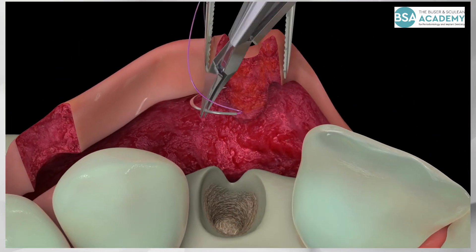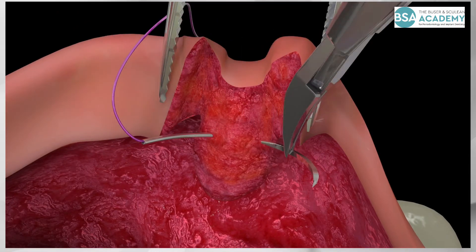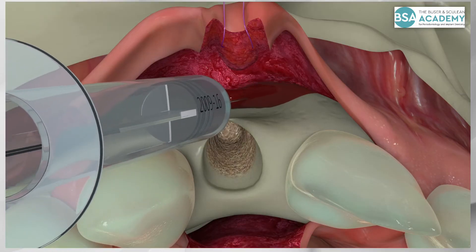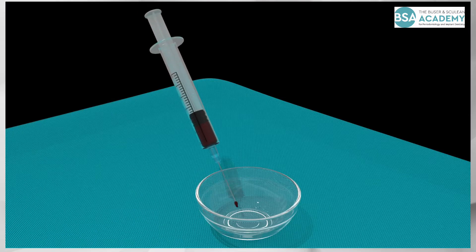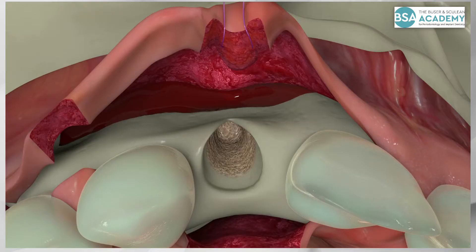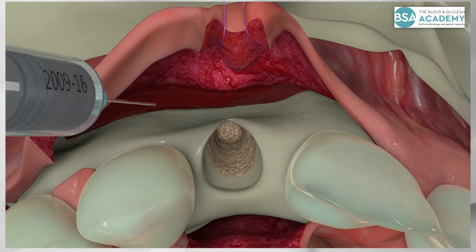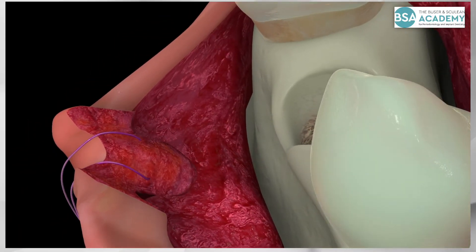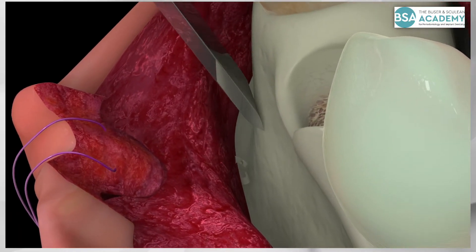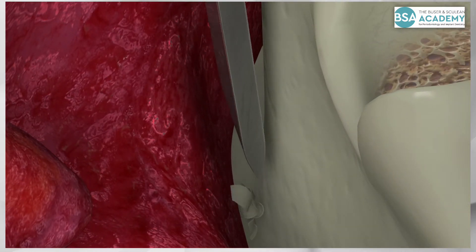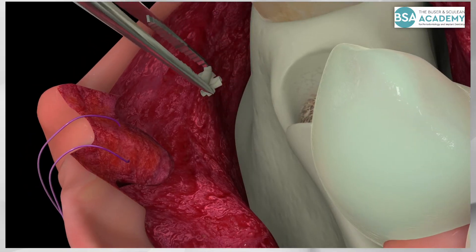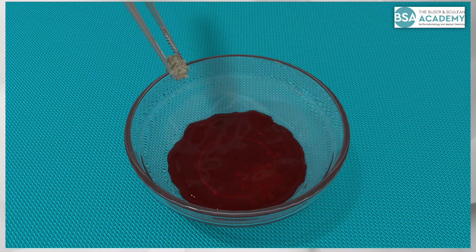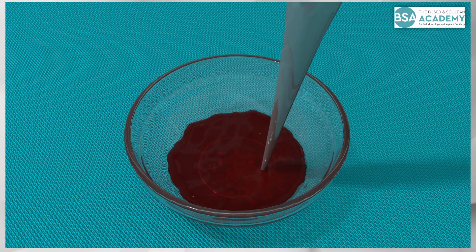A retraction suture is applied to keep the flap off the surgical site during implant surgery. Blood is harvested with a syringe and stored in a sterile dish. Autogenous bone chips are locally harvested within the same flap from the cortical bone surface — either with a flat chisel at the nasal spine, or with a sharp bone scraper from the bone surface towards the nasal fossa. The resulting bone chips are 1.5 to 2 mm in size and are stored in the blood.